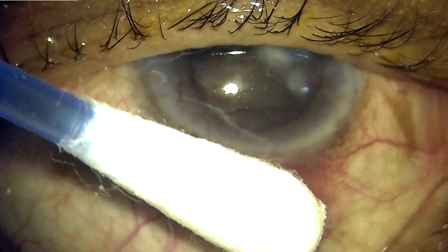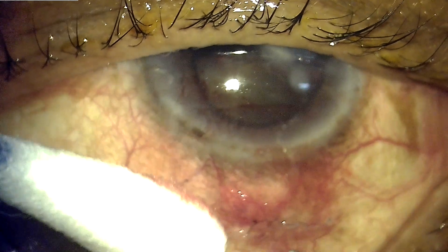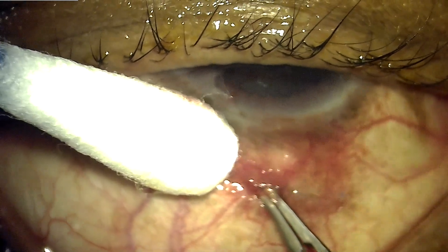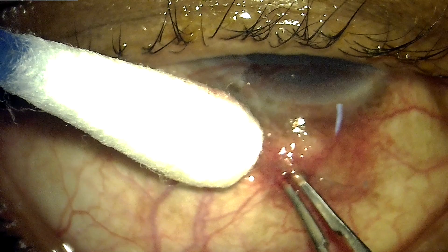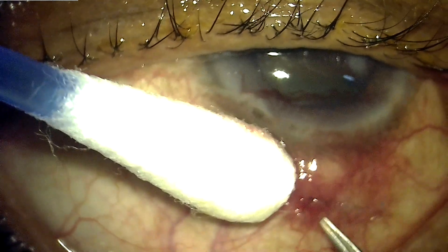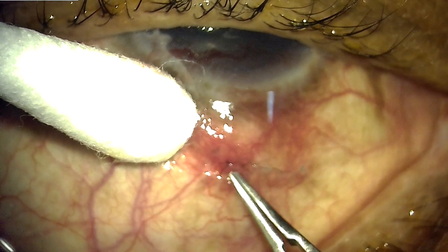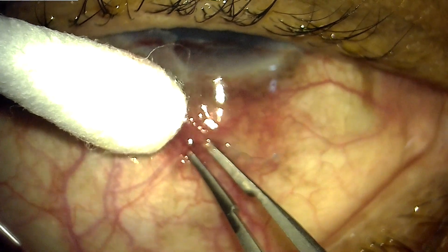Trabeculectomy is one of the most successful surgical options for patients suffering from glaucoma. At times the trabeculectomy may not cause adequate reduction in intraocular pressure, and in these situations, if the incident is very early, one can resort to removal of the sutures of the scleral flap. This will enhance the filtration and reduce the IOP.